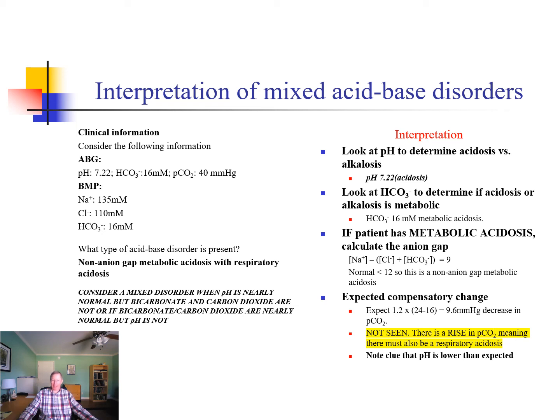That is, I have an overlying respiratory acidosis on top of this non-anion gap metabolic acidosis. So I have 2 acidoses causing this person's data to look like this. I chose this to show you because it was very similar to the last non-anion gap metabolic acidosis, but it didn't have a respiratory acidosis.